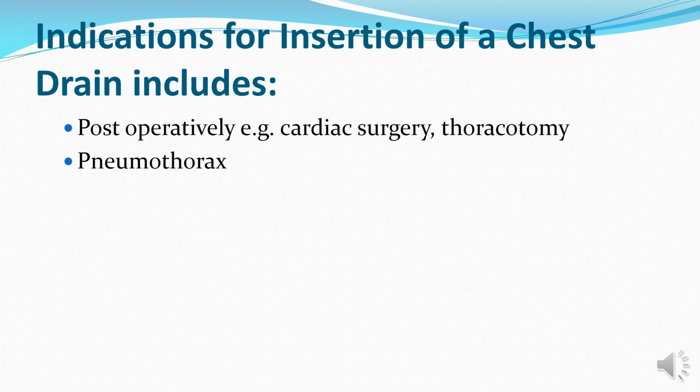There should be a certain amount of pressure which maintains the negativity to keep the lungs intact. Otherwise, if air goes in around the lungs, they will collapse. And that collapsing of the lungs, we call atelectasis. We are moving on.